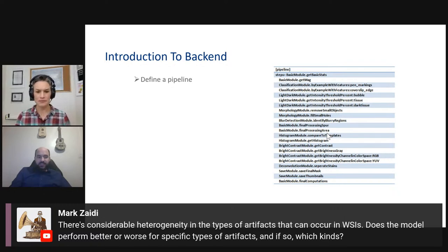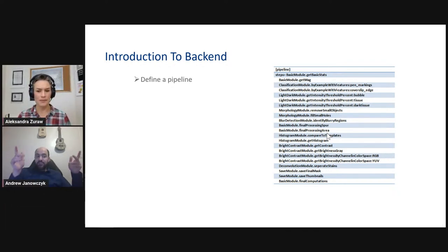What's interesting here is that HistoQC doesn't really have models. HistoQC is more of a statistical comparison. HistoQC will say this slide is not stained well because it is different from the other slides. It's not going to make a judgment for you and say this is a good slide, this is a bad slide. What HistoQC is really doing is using first order statistics to identify outliers. Its goal is to look for weird stuff, and it helps you visualize that weird stuff. For example, when we moved from H&E to IHC, we didn't change any code. We added some additional features, right? Because some of the metrics weren't as useful, or there are different things that you want to measure on an IHC versus an H&E that are really interesting for quality control, such as background staining and this sort of stuff.